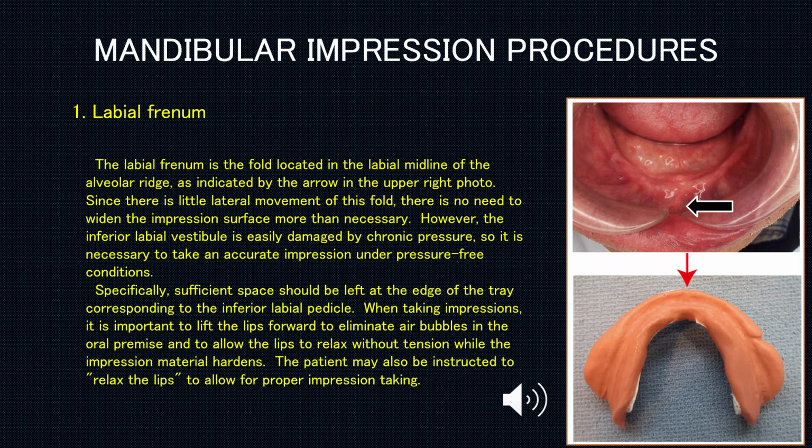However, the inferior labial vestibule is easily damaged by chronic pressure, so it is necessary to take an accurate impression under pressure-free conditions. Specifically, sufficient space should be left at the edge of the tray corresponding to the inferior labial pedicle when taking impressions.